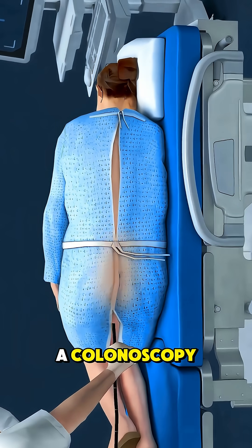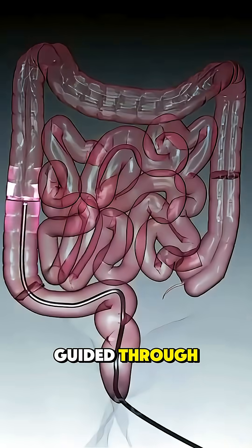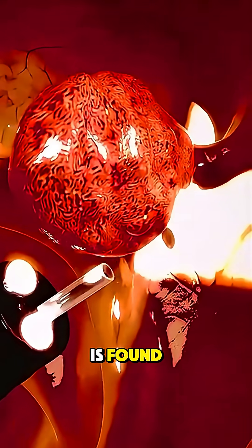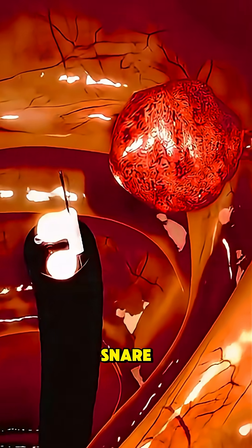It begins with a colonoscopy, where a flexible tube with a tiny camera is gently guided through the colon. If a polyp is found, doctors insert a special tool through the scope — usually a wire loop called a snare.